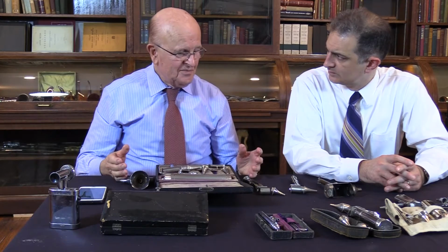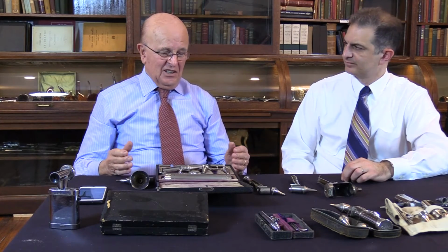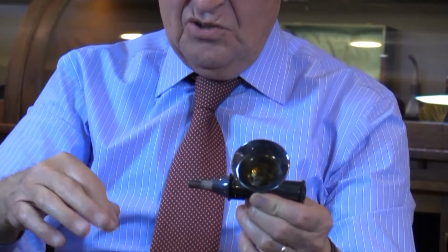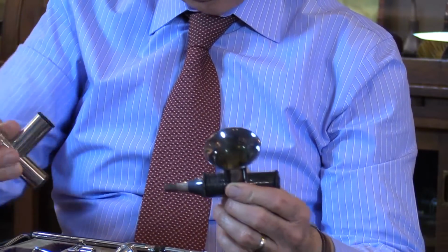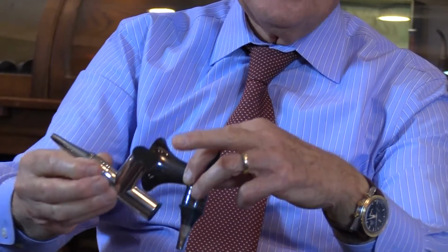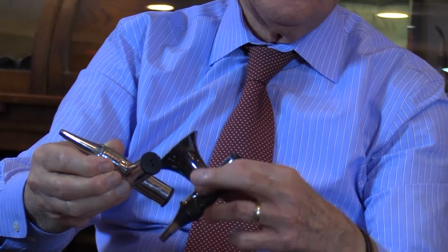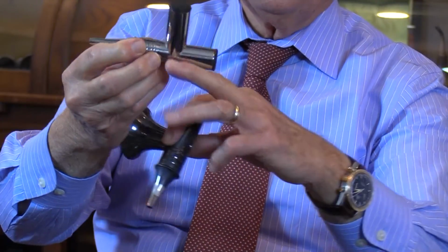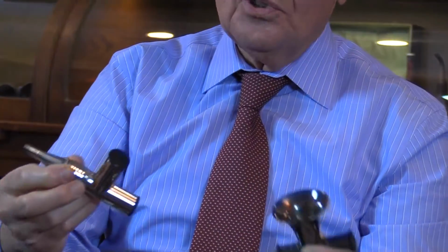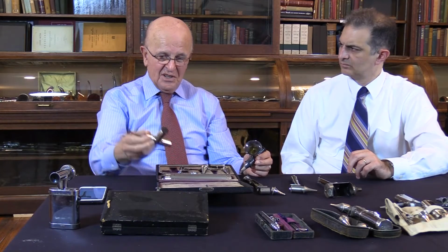So the biggest breakthrough regarding lighting is when electricity came into play. And we'll go back to the Bruntons. That's the Brunton, where the light will go from the sun or whatever and reflect to the ear speculum. And this is the very first electric otoscope. It's, as you can see, a Brunton. It's an exact Brunton, except that there is a bulb here, and that's where you hook it to the electricity through these two holes here. So it has the same principle, the 45-degree angle mirror with the hole in the middle where the examiner looks through and the light will go through. So now they don't need sun, they don't need a kerosene lamp or any source of light except for electricity.